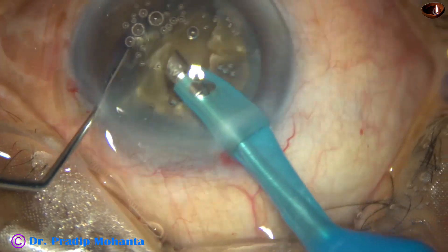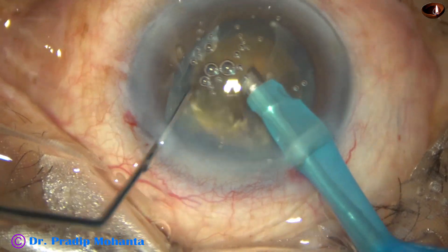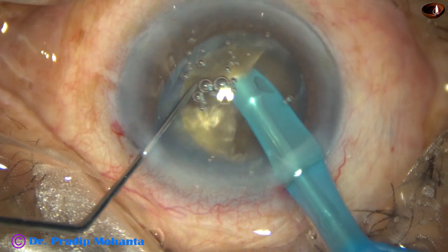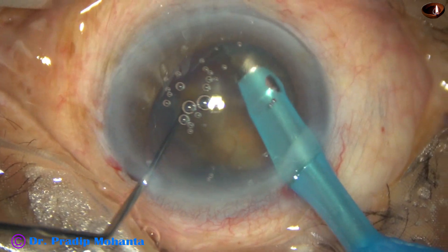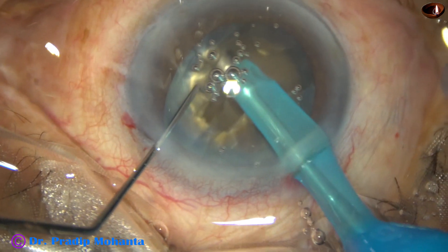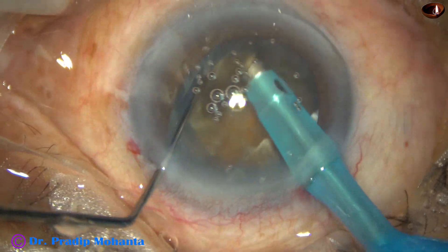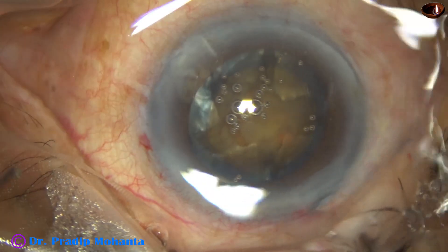A lot of air bubbles are filling the anterior chamber, sticking to the back of the cornea. You can see that the air bubbles are not moving. And this is a nice crack. So I am doing as many cracks as possible.